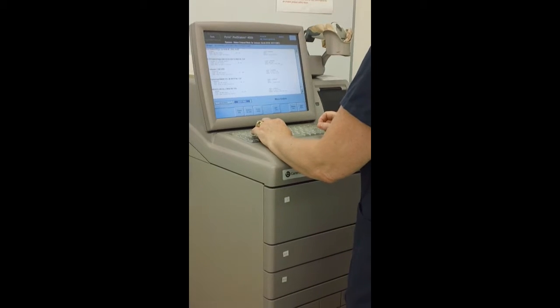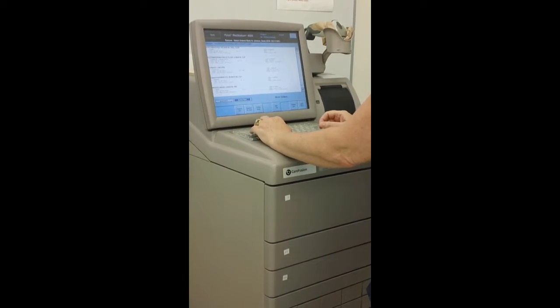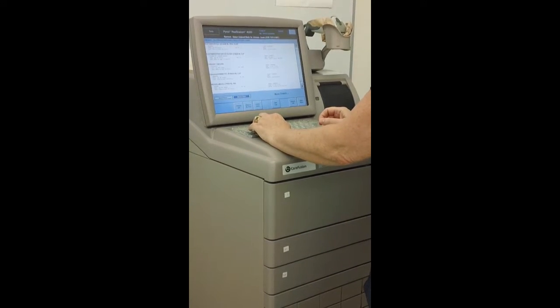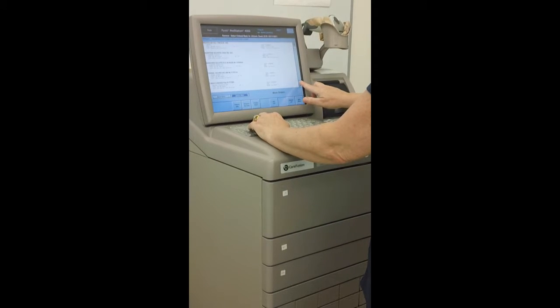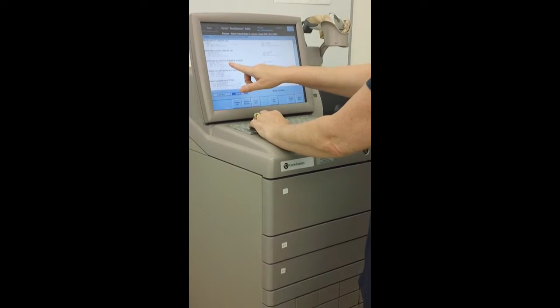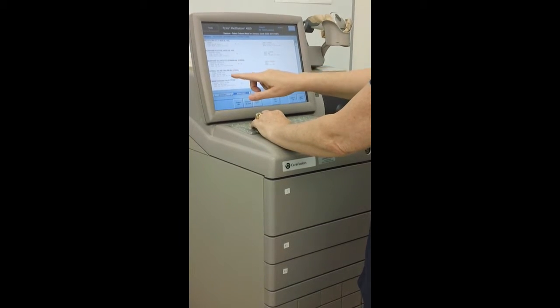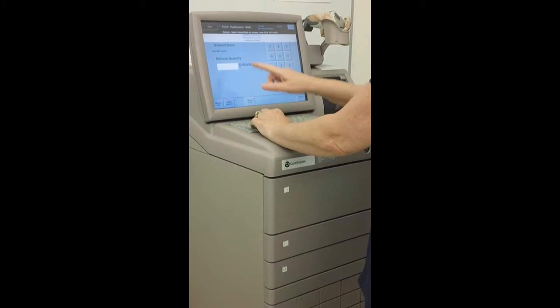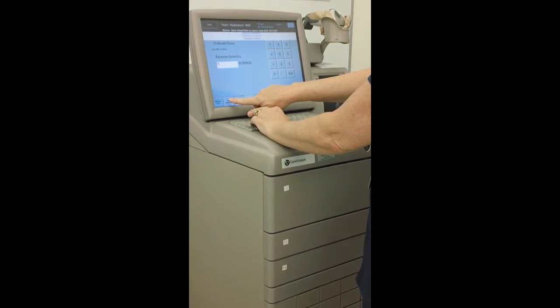Now the things that I'm getting out, this has all of his meds here. And what I want to get out is a PCA syringe and the PCA keys. So I don't see them on this page, so I'm going to scroll down. And right here I see morphine sulfate, PCA 30 milligrams in a 30 ml syringe. That's what I want, so I'm going to select that. I need one syringe.